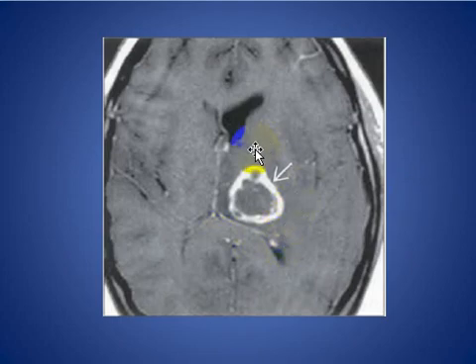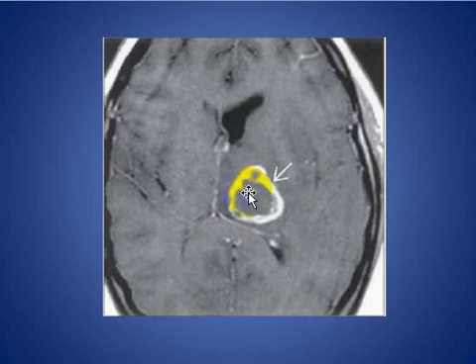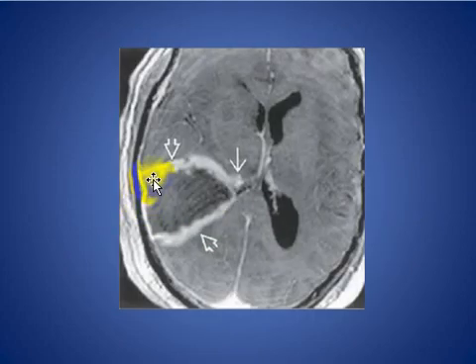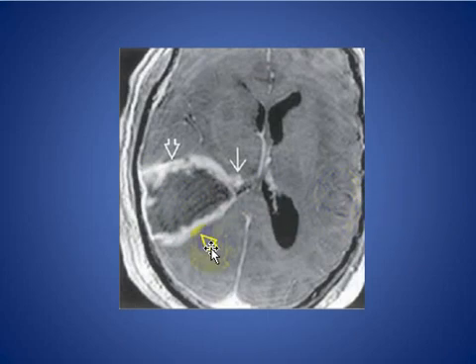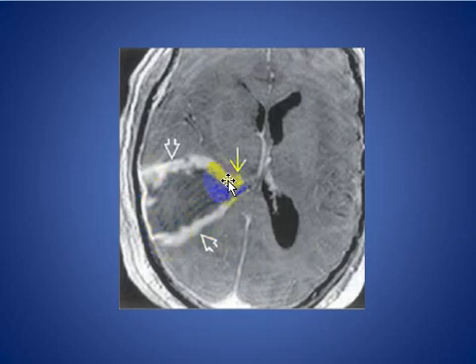Here we see T1-weighted MRI with an enhancing mass in the left thalamus, deeply located with necrosis, histologically proven glioblastoma multiforme. Another case shows a large glioblastoma multiforme with subependymal involvement, meningeal enhancement, central necrosis, and a vigorous enhancing wall.